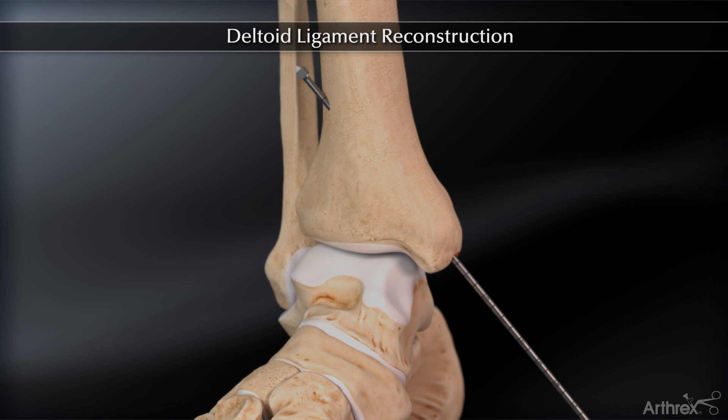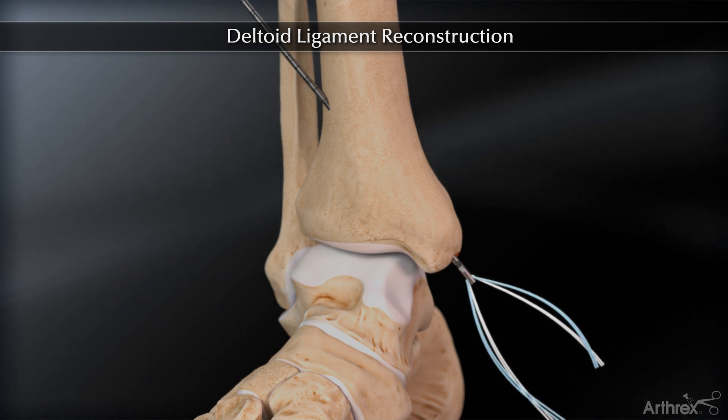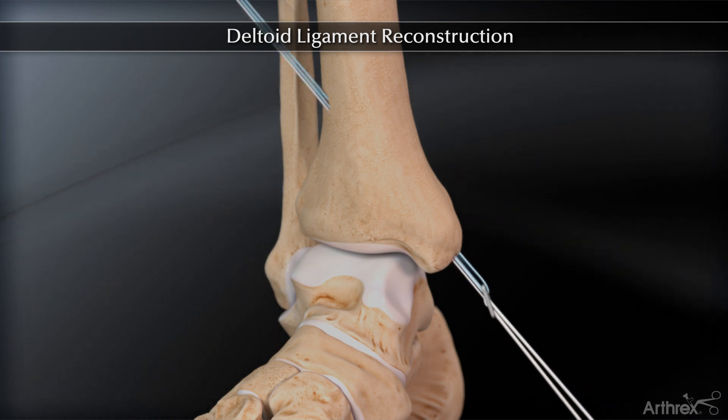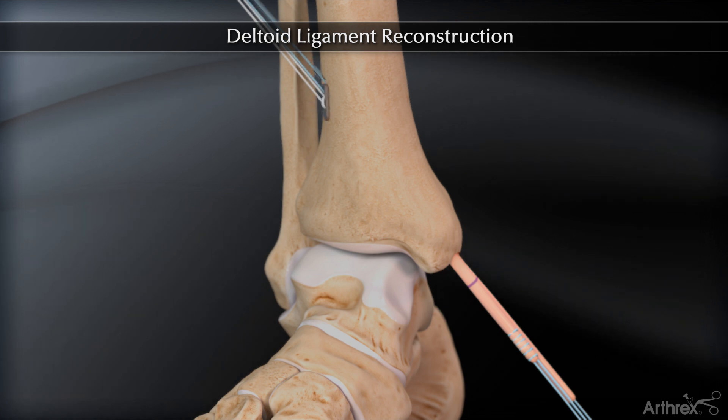The tendon graft is looped through the tightrope device and the four fiber wire sutures from the tightrope construct are then loaded through the open eyelet of the pin to be shuttled through the medial malleolar tunnel. Pull the sutures proximally until the button exits the tibial cortex. Under fluoroscopic visualization, pull tension on the free limbs of the graft construct distally to ensure proper tensioning of the button.